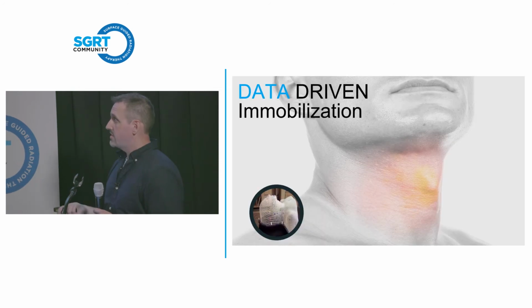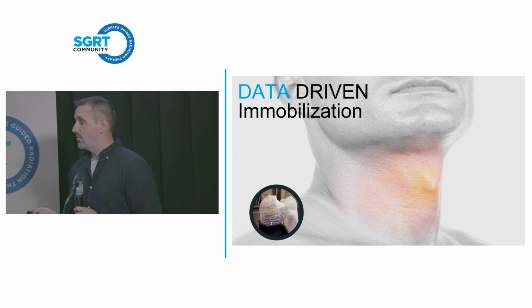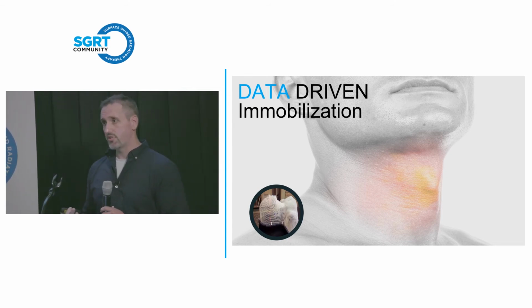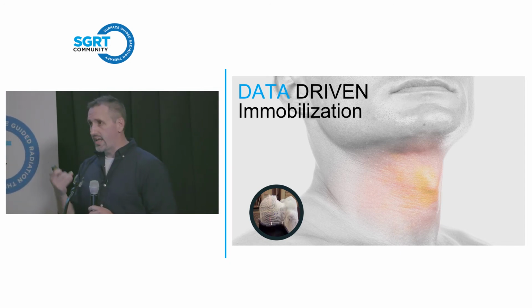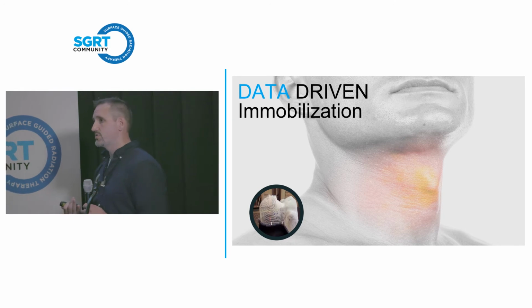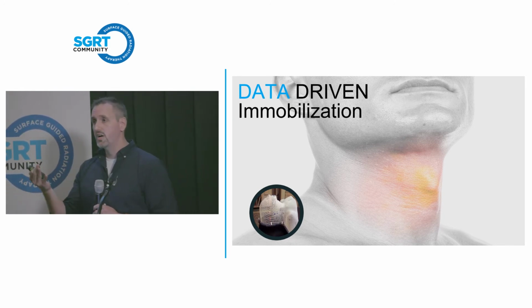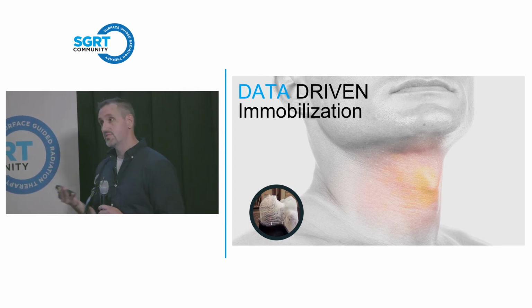in data-driven immobilization. We're all very familiar with the full-faced head and neck masks. We found that we could replan head and necks much less if we keep the posture correct. So the C-spine curvature, the base of skull position, all of that. The weight loss is far less of a dosimetric impact on these patients because we're delivering with VMAT. So you're going through very few monitored units through the areas where you're seeing weight loss. So you don't see as much of an impact as long as the posture is correct.